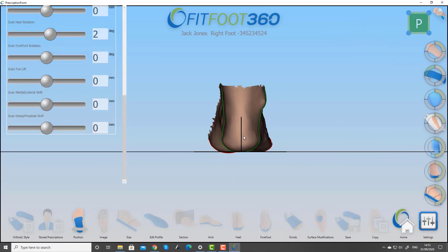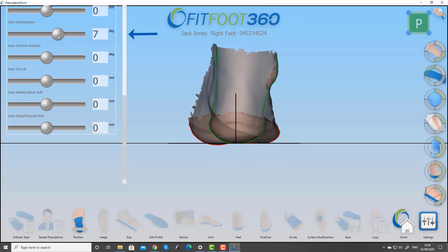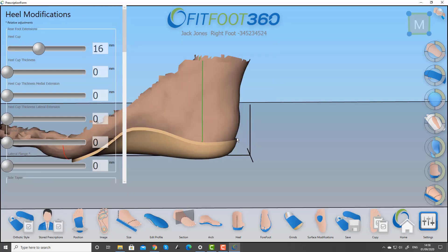One of my favourite features in version 3 is the ability to visualise the forefoot-rearfoot relationship when you're doing scan manipulation, or more importantly when you're aligning the insole to the heel. So now you've got total control over the position and orientation of your device.